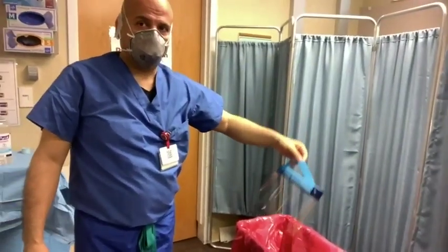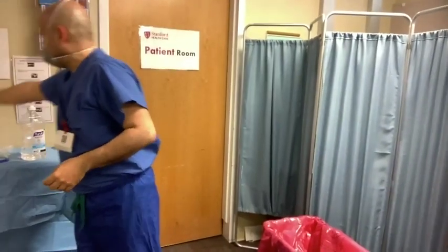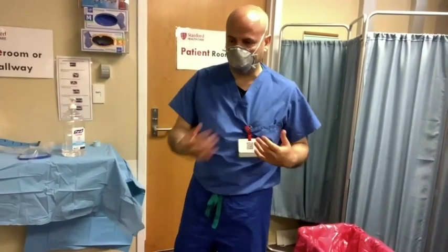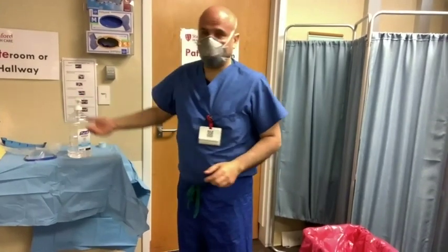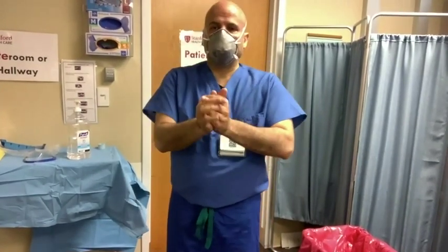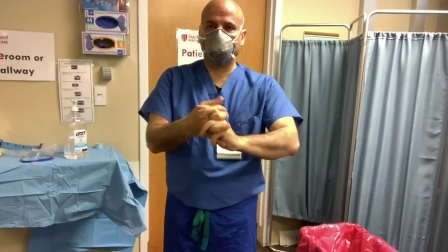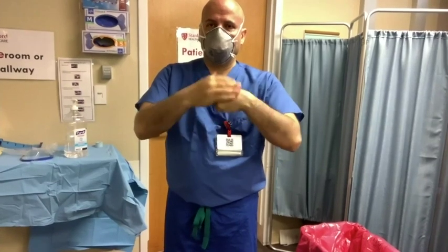Sanitize your hands again for another 20 to 30 seconds. Note: we have not disposed of the face shield here because we're using it for future sessions, but you should discard it. Once Dr. Nassar completes that step, he'll be ready to turn the knob and exit the patient room with very clean hands.